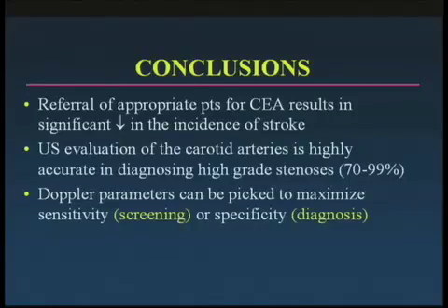So in conclusion, I hope I've been able to demonstrate to you that doing accurate carotid ultrasound can help you refer patients for carotid endarterectomy, and the referral of appropriate patients will result in a significant decrease in the incidence of stroke. Ultrasound evaluation of the carotid arteries is highly accurate in diagnosing these high-grade, clinically significant stenoses in the 70 to 99% range.